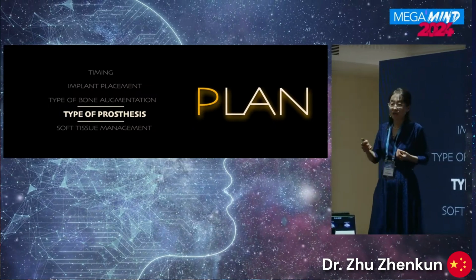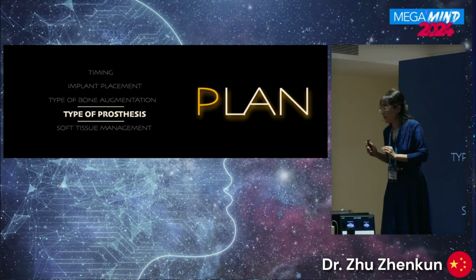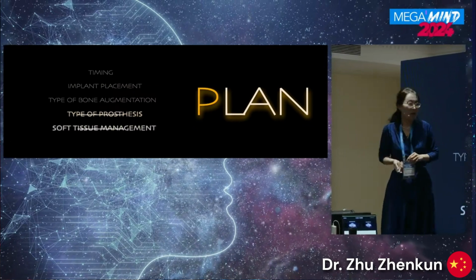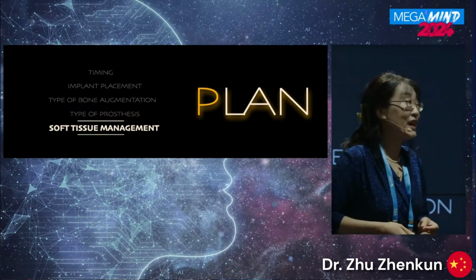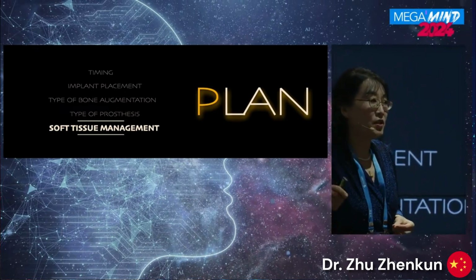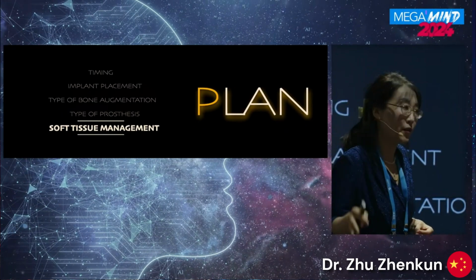So I think the design of the restoration is a really tough and very important task for clinicians, because we need a good design to achieve stable and optimal outcomes. But even if we have done the first 4 key steps very well, immediate implant placement may not be able to predict the final soft tissue level.